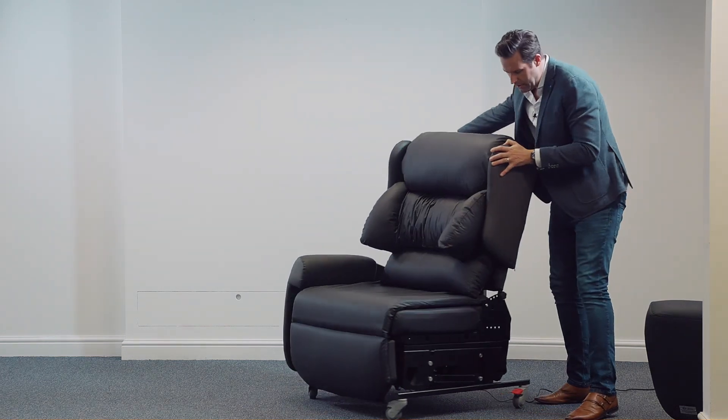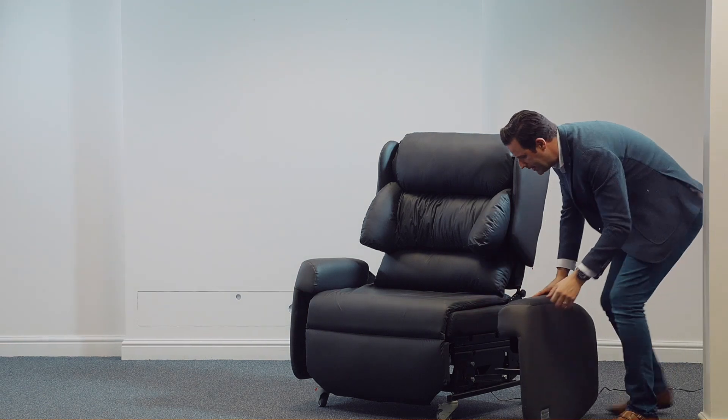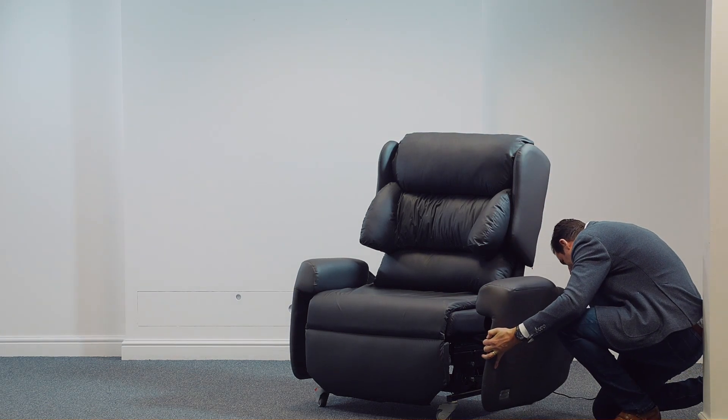So let's just bring the chair back and we can simply slide the arm back in.